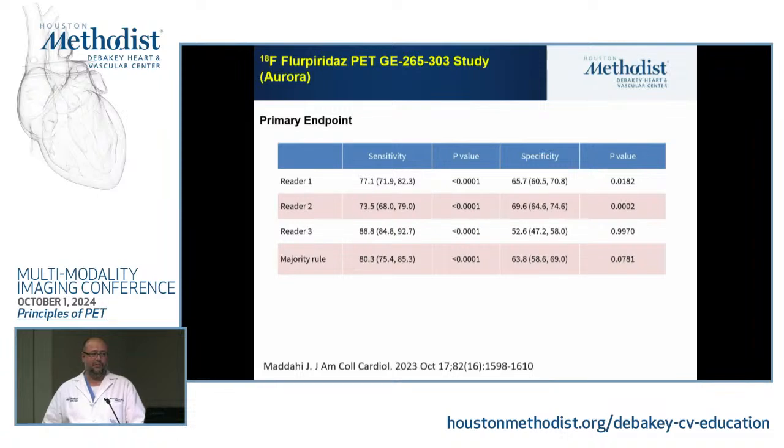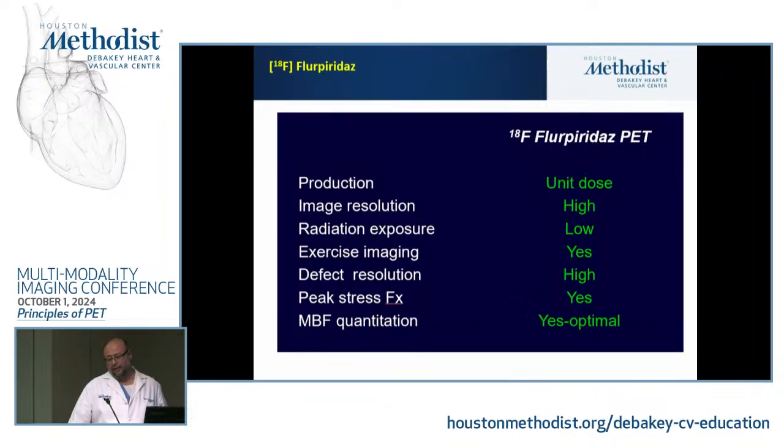As you know, when we read PET, we don't just look at the static and gated. We look at EKG, we look at calcium score, we look at flow data, we look at multiple things. So these results you see are just results of the static and gated, by the FDA requirement for interpretation. So how is this going to change?